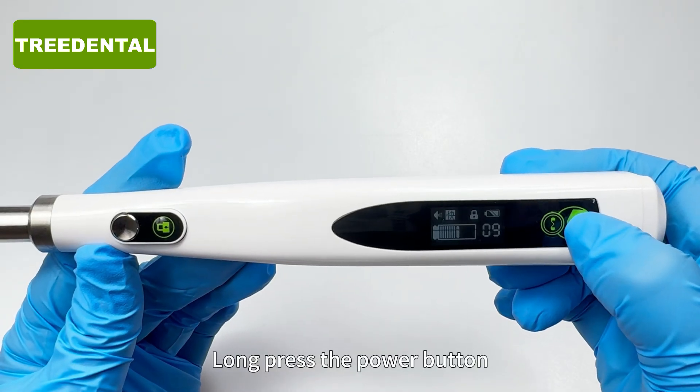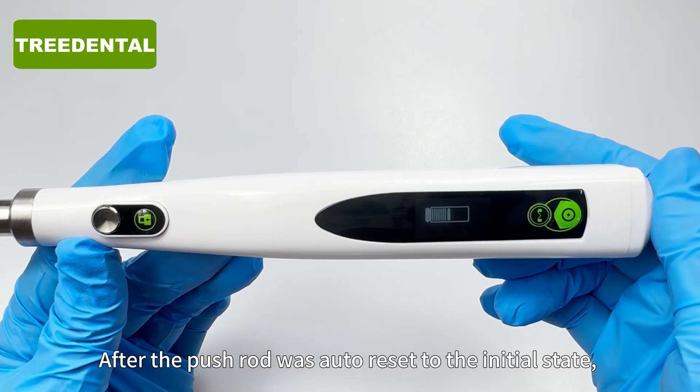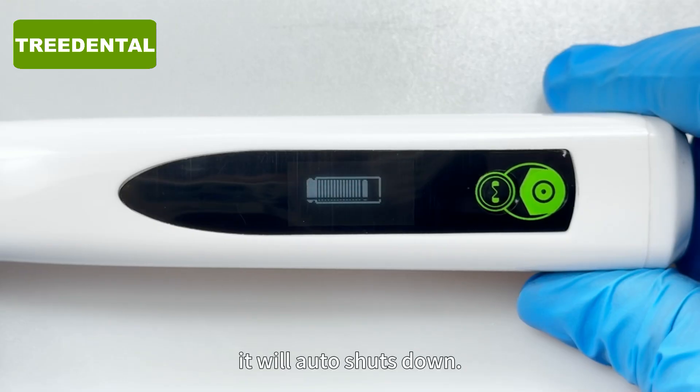Long press the power button. After the push rod auto-resets to the initial state, the device will auto-shut down.